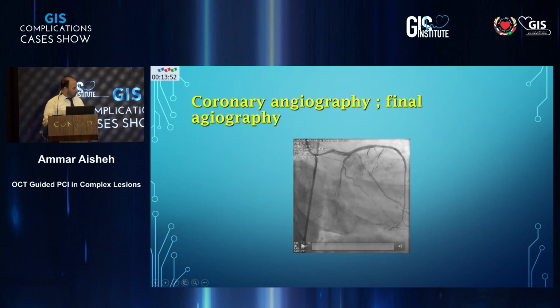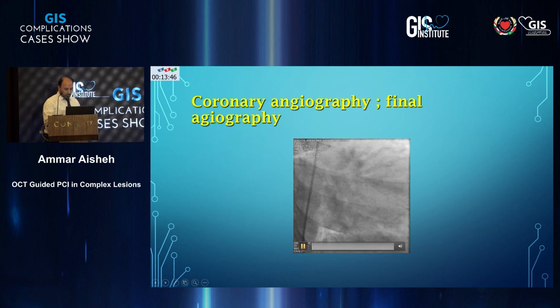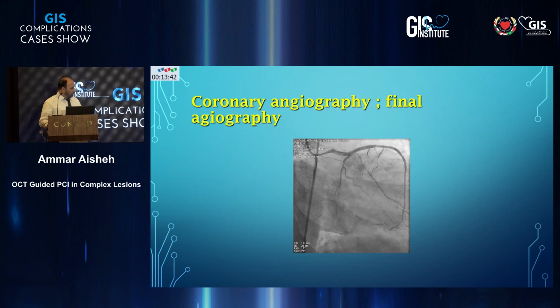Again, we should pause before we reach the OM. So now we have already treated an LAD that was diffusely diseased. A lot of points have been learned from the strategy of fixing the LAD. With the OCT done before, there was no preparation. Understanding the morphology was very important.